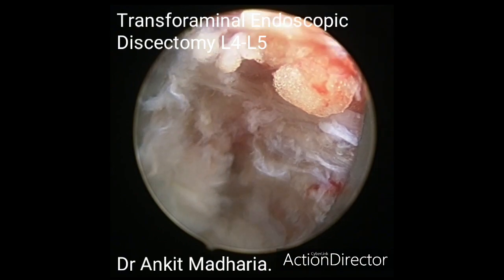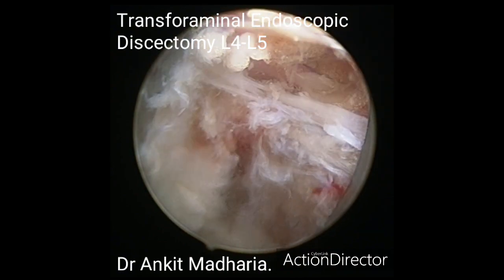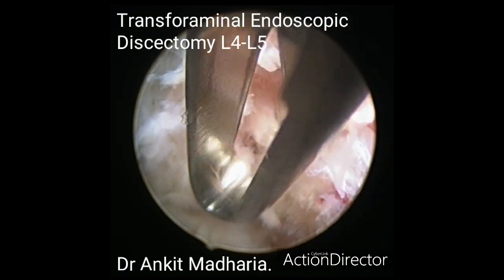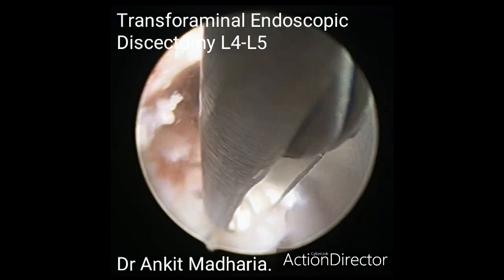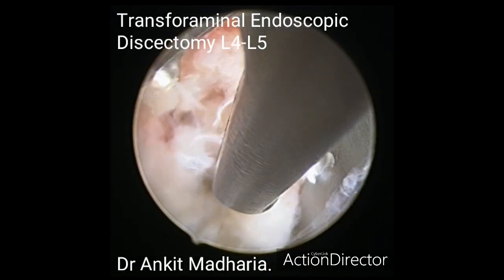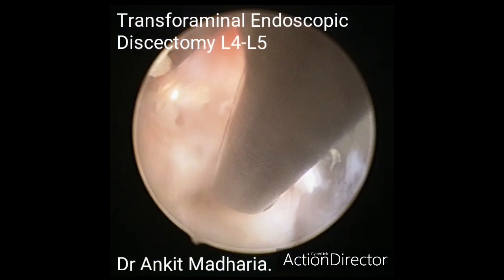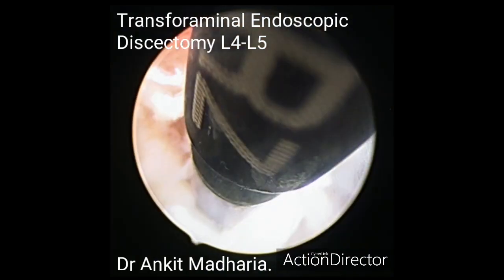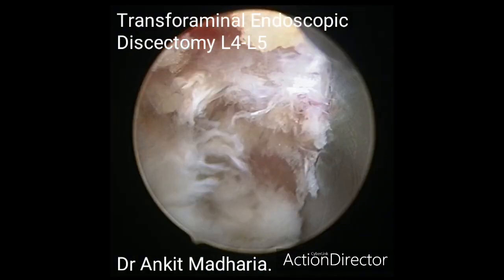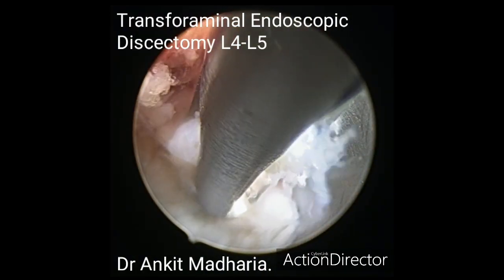The fat tissue can be seen coming in and out through the epidural space. The fibers of the edge of the annulus were cut using an annulatome. This was done to access the central and paracentral portion of the disc.